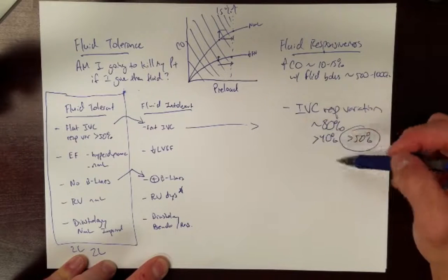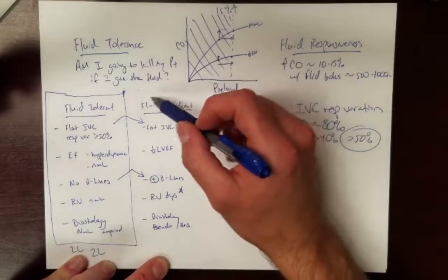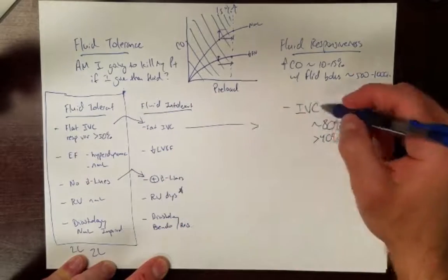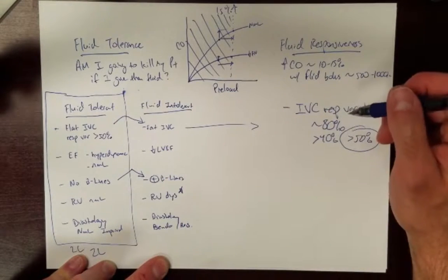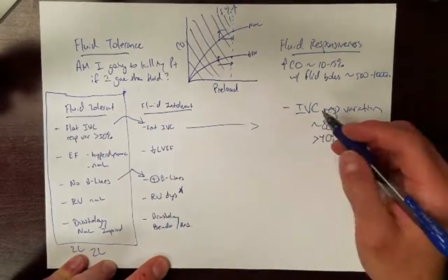I don't necessarily use this as a measure of fluid responsiveness. I feel like if the patient has enough evidence of fluid intolerance, I want something a little bit more accurate than just my IVC. Keep in mind, I do use the IVC over here when I'm assessing for fluid tolerance.